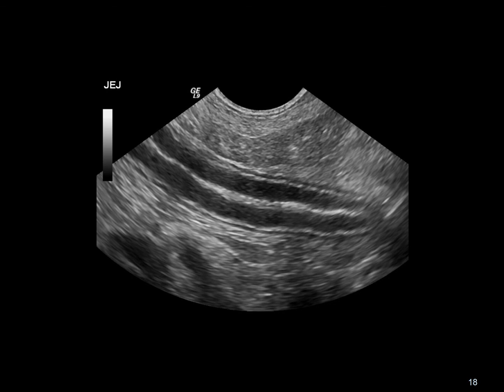I've talked about this before. We'll talk about it again later when we talk about the GI tract specifically. But again, you should be able to see the nice layers of all of the small intestine, assess the GI tract for dilation, luminal contents, and so on. And that pretty much is the quick run-through of the abdominal anatomy. We'll hit more details as we go through the rest of the lectures in this semester.